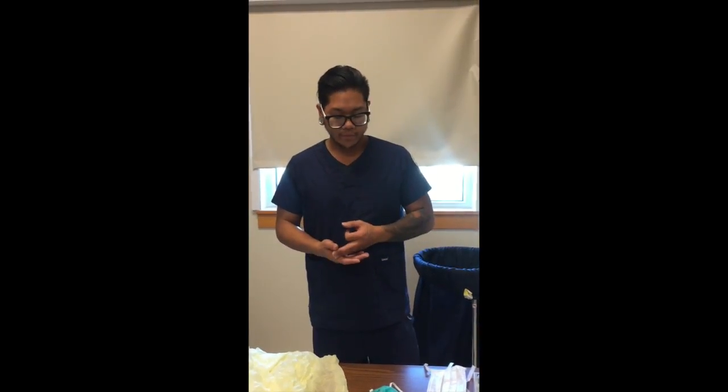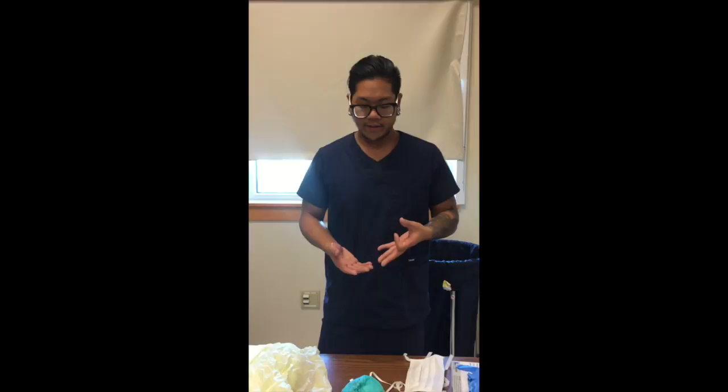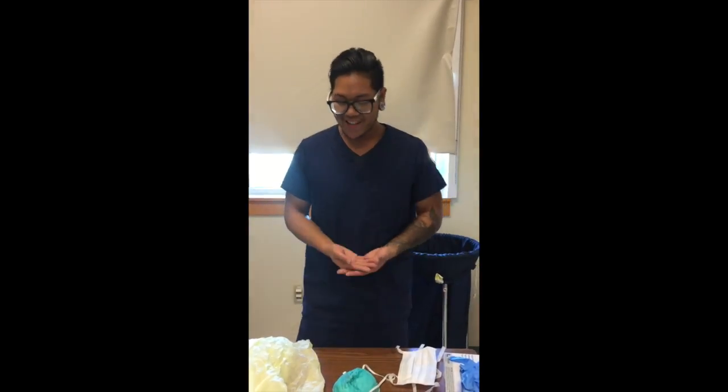For airborne, you want to wear your N95 mask because the patient can have TB or influenza, like a flu or anything, and those particles can get into you and make you sick. So that's why you want to wear that. And then there's one more.